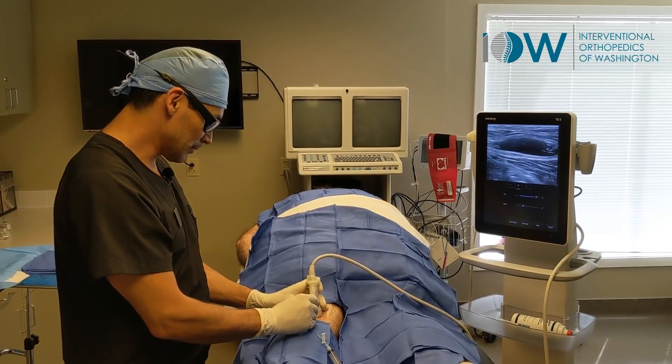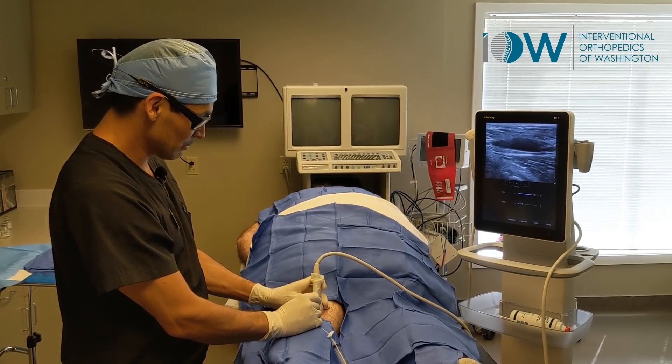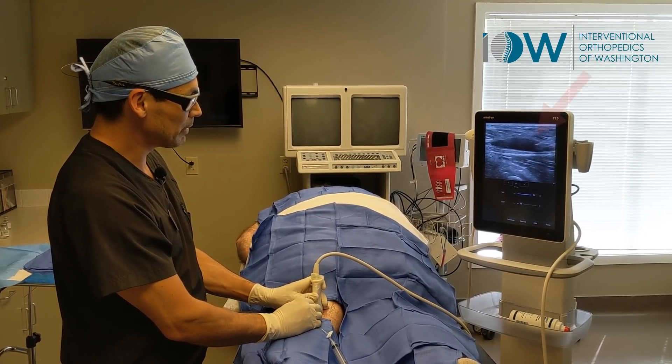So we're going to drain that out because we're doing a PRP treatment today and we don't want that fluid in there when we're treating the knee with platelets.